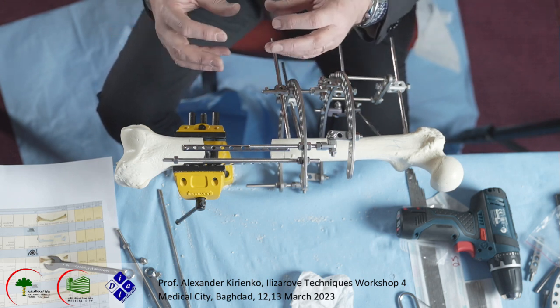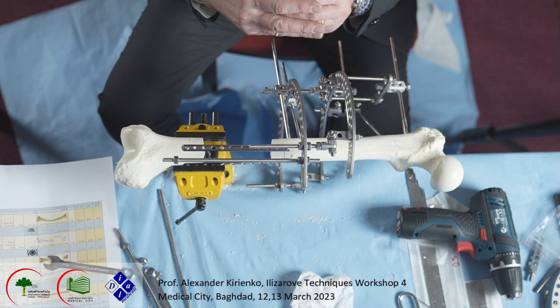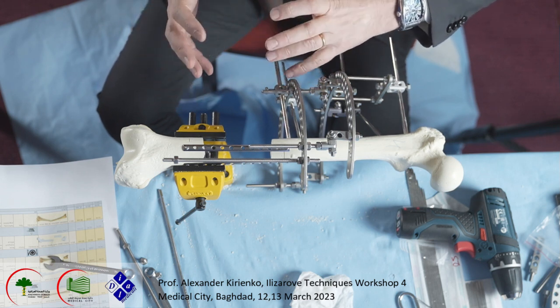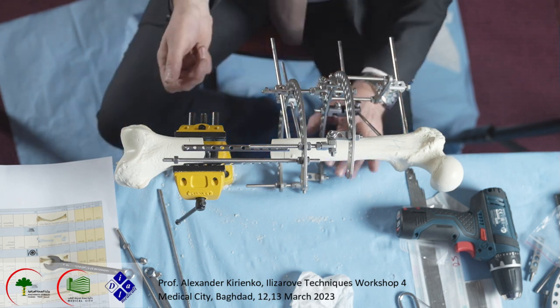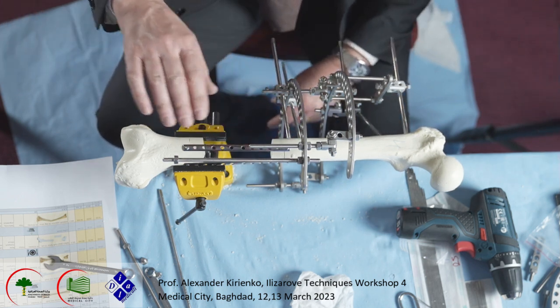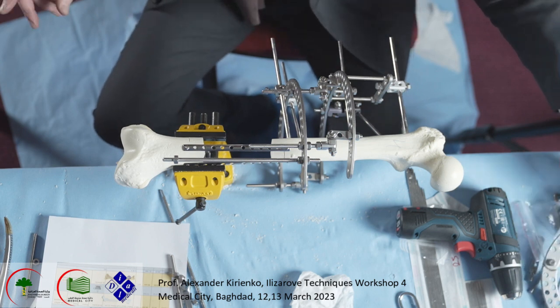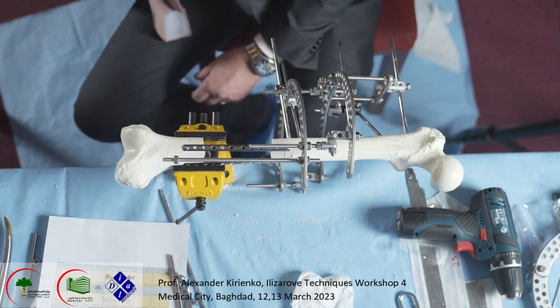Because you do a little bit of shortening. If the defect is small, 4 or 5 centimeters, you do acute shortening, and the docking site works from the first day of surgery. If you can't do too much shortening, you do partial shortening, and you recover with lengthening in the future. What we do now, we have a plate here, we maintain the distance, we don't remove it, we mount our ring here. This 180? Yes, 180. Big one.